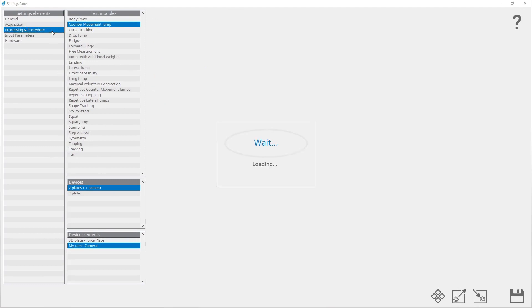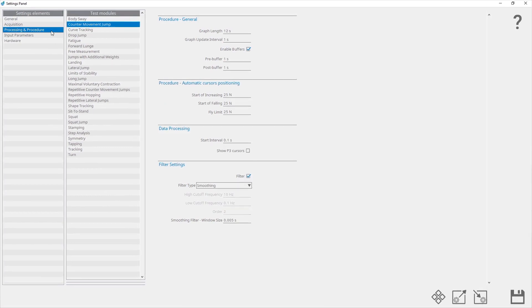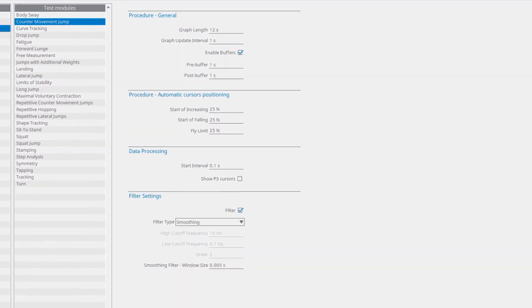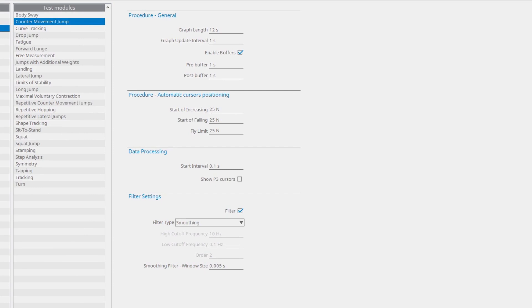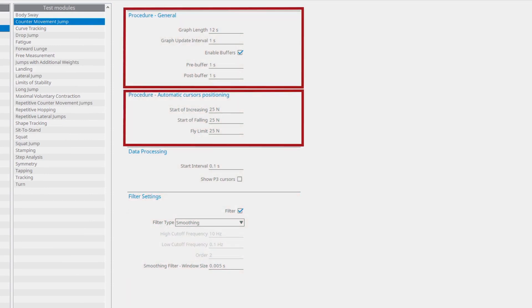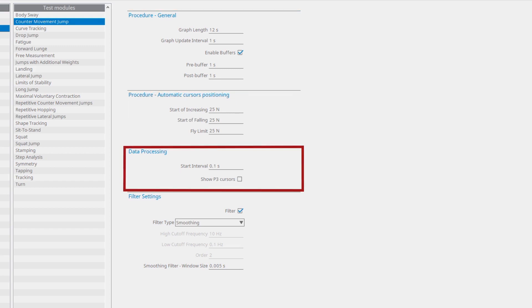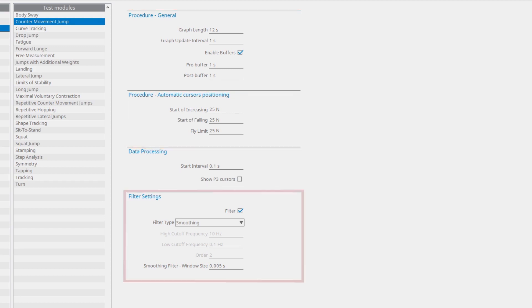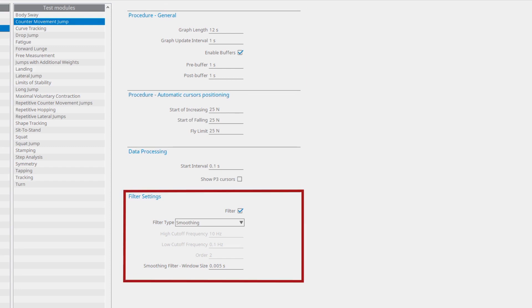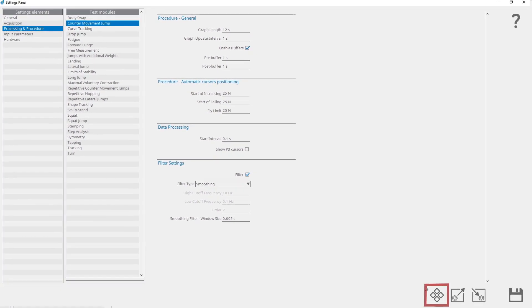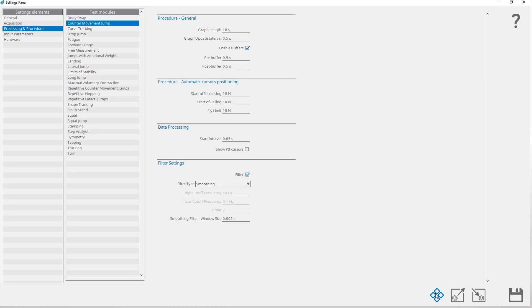Under processing and procedure, the settings for analyzing and data processing can be set up for each test module separately. In general, parameters are divided into four groups: the first two groups deal with the test procedure, the third deals with data processing after the test is finished, and the fourth group is about signal filtering. By clicking on the load default values button, default parameters for a selected test will be loaded but not saved. If you want to save the default values, you have to click on the save button after you load the default values.